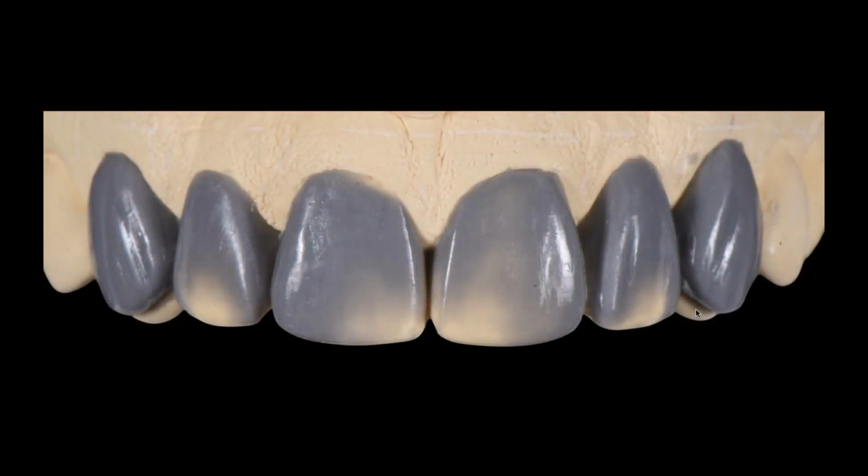We originally planned this case as a 6-unit case. And it was interesting because, again, not a functional lecture, so I won't go deep into this, but it turns out that the tips of the cuspids were the only actual home spot, or area where the patient actually hit when they closed. And if we would have taken away those cuspid positions like we originally thought we were going to, we would have lost his whole occlusal table. So we decided to not do the cuspid and treat this as a 4-unit case, which, by the way, I would argue is always better.